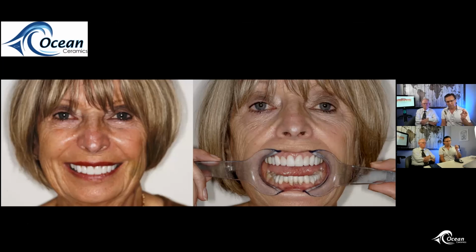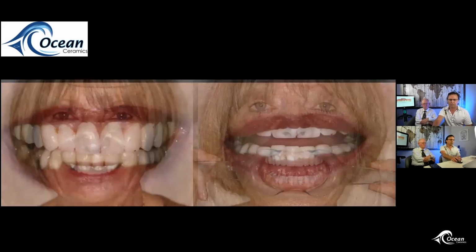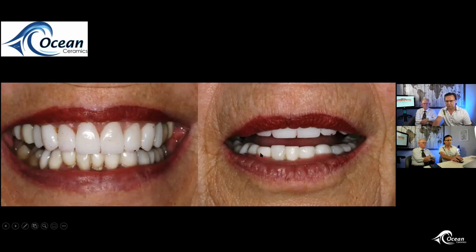And I could tell within a snap that the temps were just a little bit too long. So I says, look, Heidi, snap the photos. We import these photos and we remount and reevaluate how we're going to make the changes into porcelain. So once again, here are all these lipstick spots. This is the E on the left, and on the right, this is M. I want to see these centrals just about another half millimeter shorter.